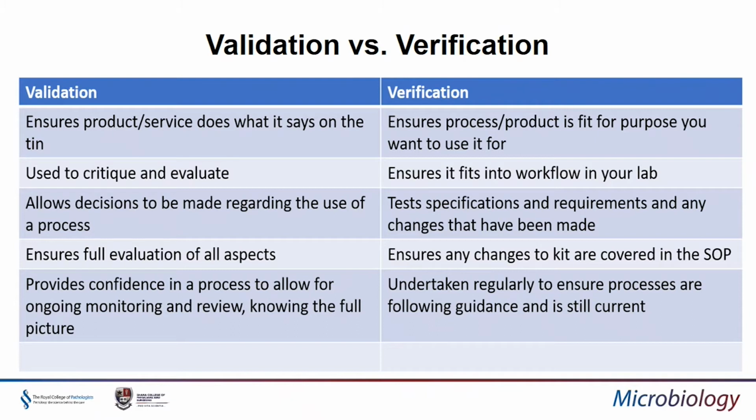Whereas verification ensures the process or product is fit for the purpose you want to use it for. So it might be a particular molecular test that picks up this particular resistance mechanism, but where does it fit in with one specific laboratory? So it ensures that it fits into the workflow in your lab. It's pointless you having a test that does this, but then you get no samples to test it for. So you need to verify it in that way as well.